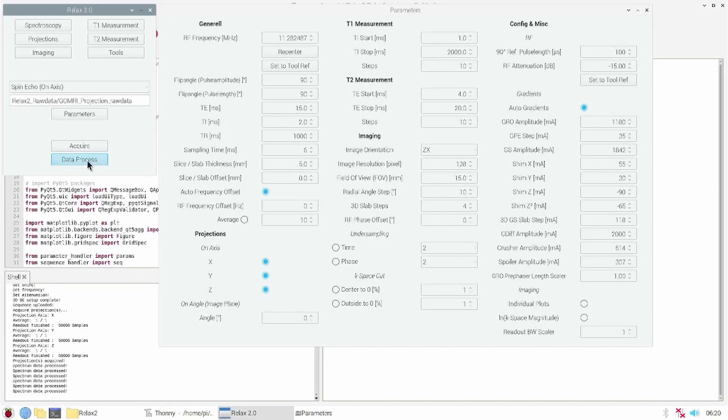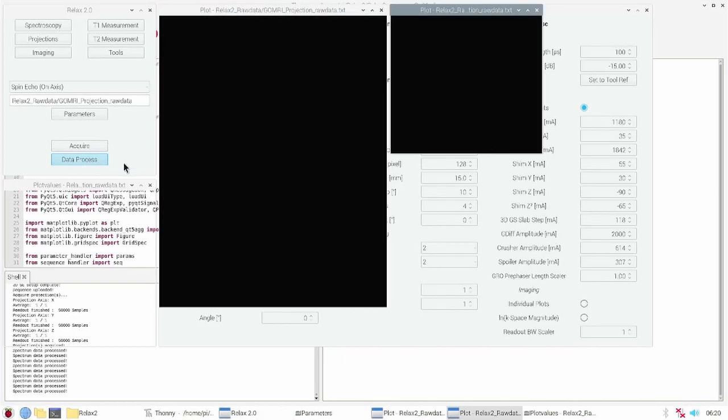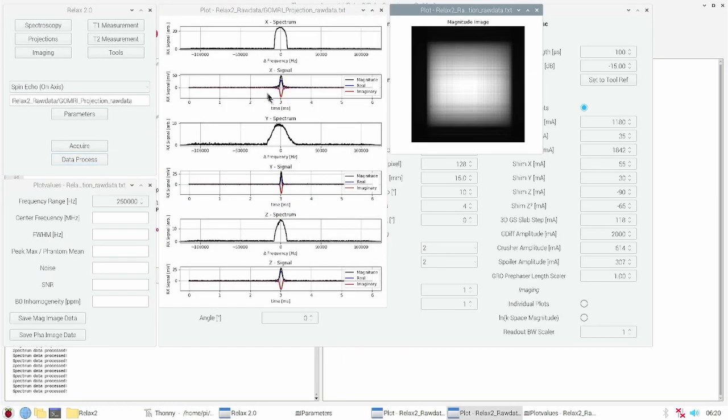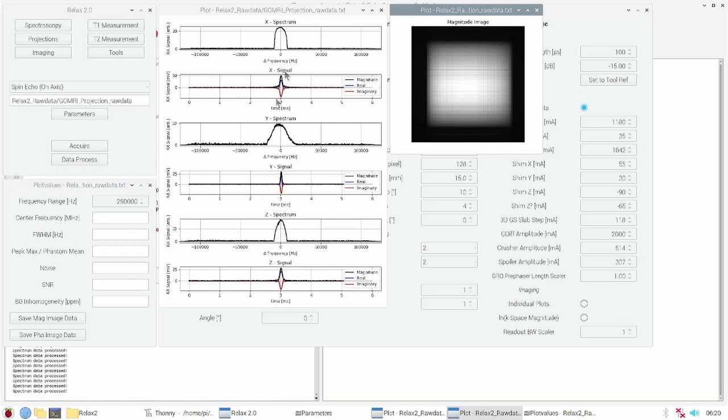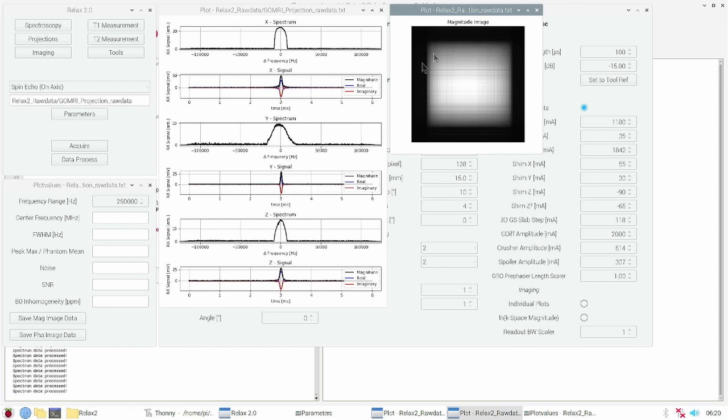After the measurement I can process the data and the projections are plotted. You see the projection for the X, Y and Z direction. In the tabletop orientation a cross section of the chemical test tube is the X and Z spectra, which you can see here. This is just a test tube full of water.